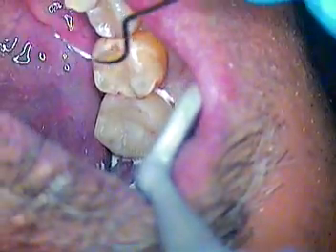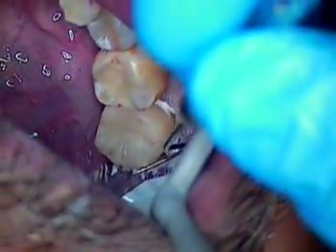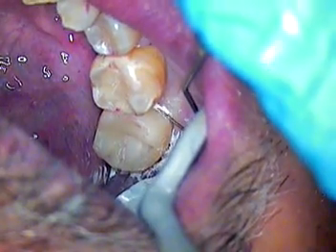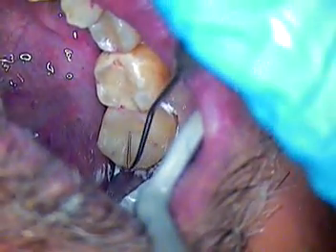Welcome back. We're just waiting for Duralon Cement. This is our permanent temporary cement that we love to use — we rarely get any complaints from our patients. It's going through a phase now of setting. You can see it's kind of like a cobweb look to it, so it's a little premature to be removing any of the cement.